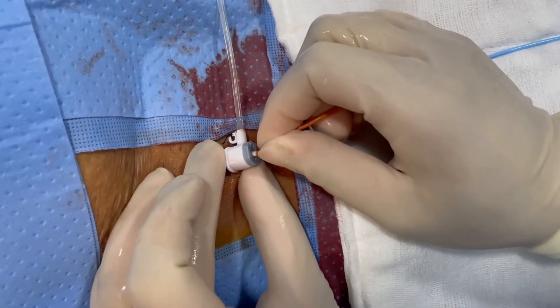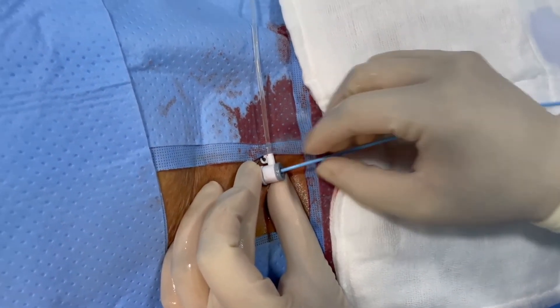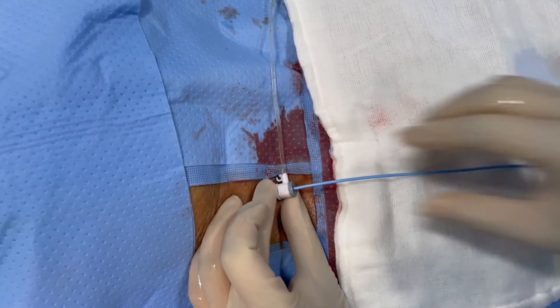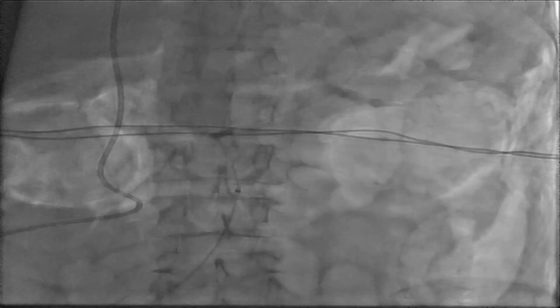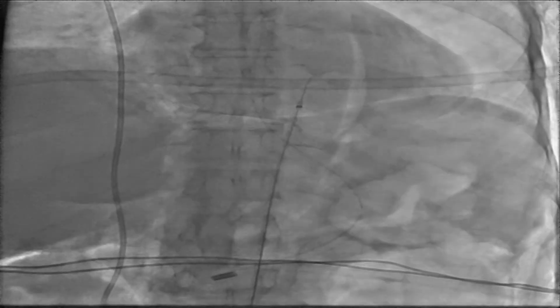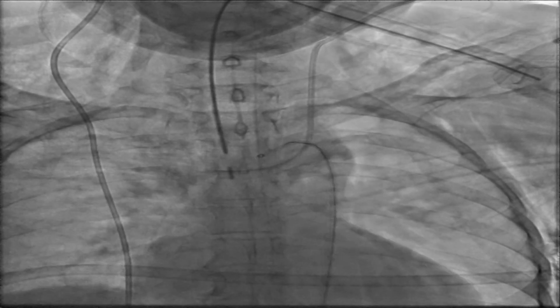The catheter with Terumo wire is introduced through the femoral sheath and advanced over the wire. The wire must be ahead of the catheter by at least five centimeters. The catheter over the wire is advanced up to the arch of the aorta under fluoroscopy. We take an arch aortogram to see the origin of the vessels. Generally the arch aortogram is taken only in difficult access. We take a roadmap, turn the catheter tip upward, and advance the Terumo wire into the common carotid artery, then advance the catheter over the wire.